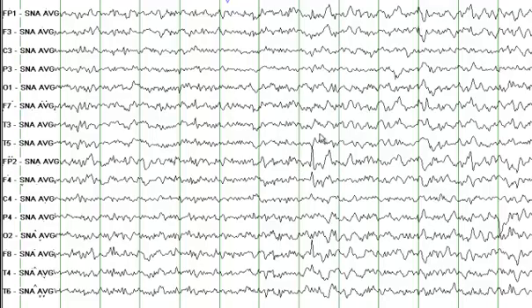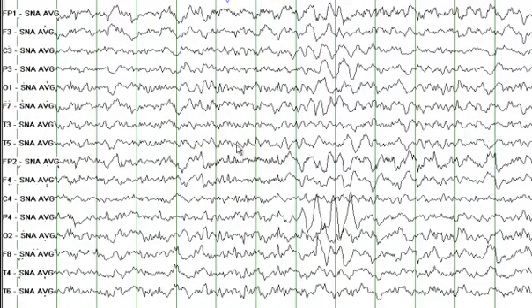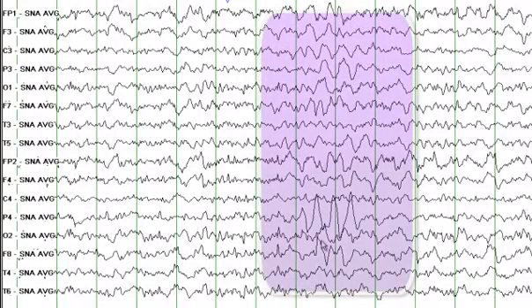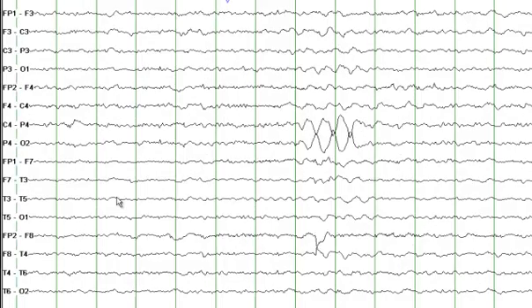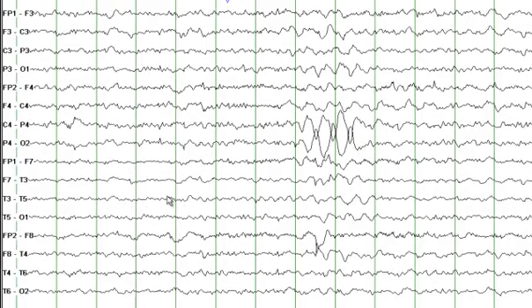The sharp waves are seen again on this page. You are seeing a generalized slow activity — between those two green lines you see delta activity here, so there is a burst of delta activity seen in both hemispheres. I will now change this to a bipolar montage. What you see here is the slowing which we saw on the average reference montage. There is some artifact at P4 which got averaged and was showing up on the average reference montage.